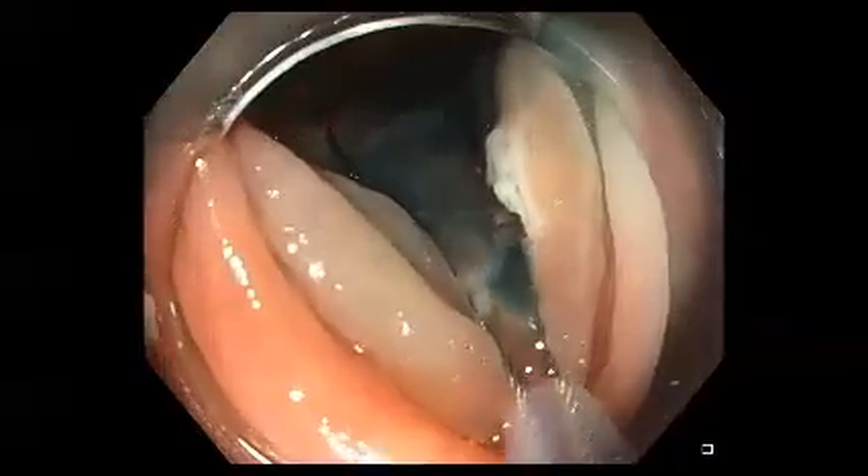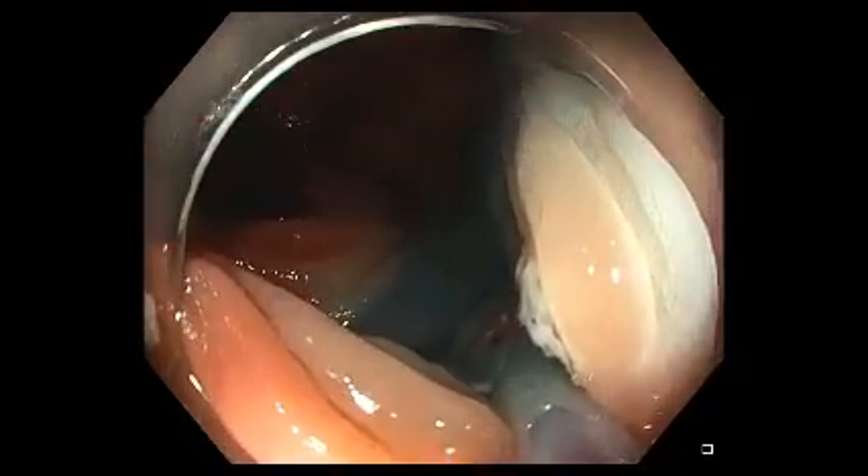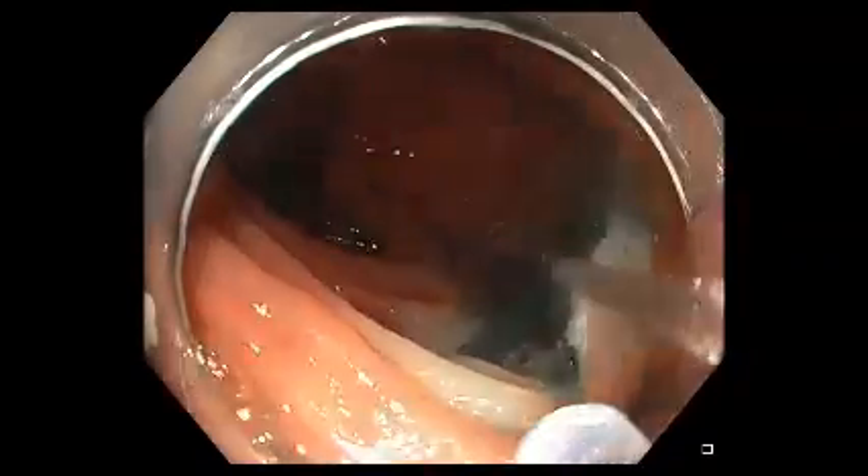You can see as we inspect this site carefully, particularly as the wire is closing around it, that there is some residual serrated tissue with the same small serpiginous vessels.